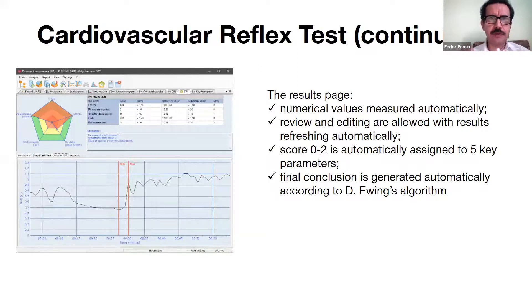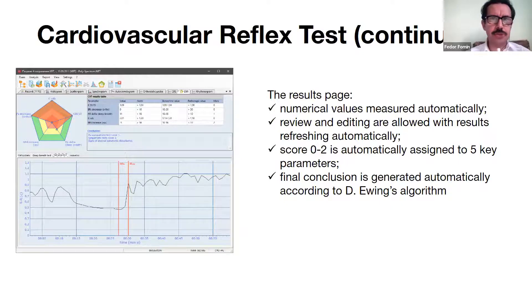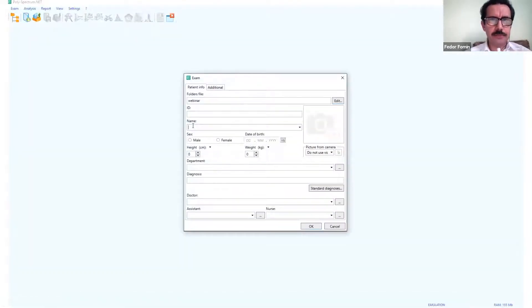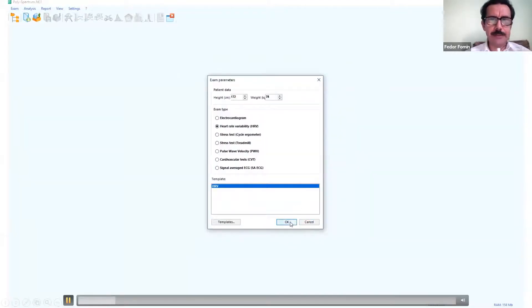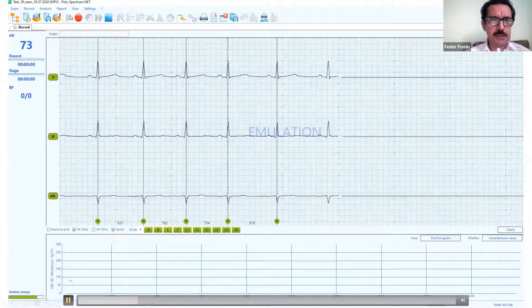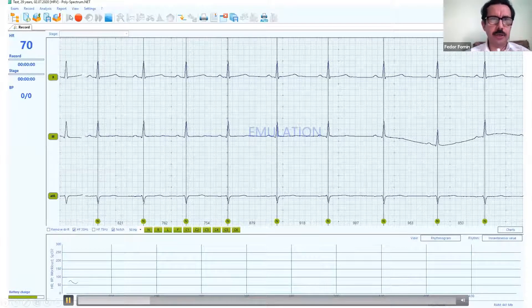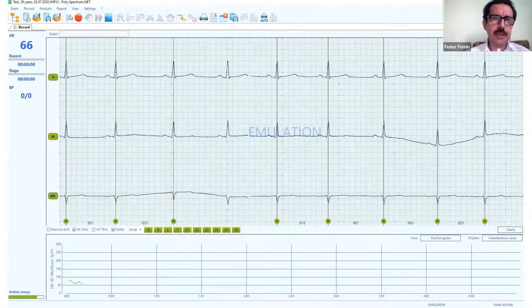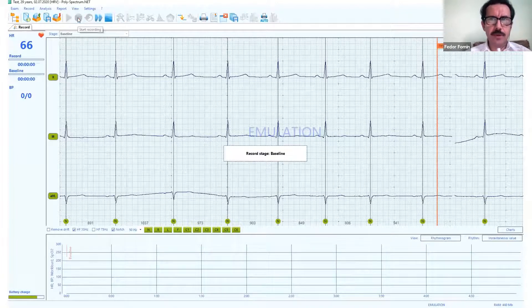This information can change treatment tactics and patient management, and the result is given as a scale from zero to ten, where ten means everything is wrong. Now in this short video recording demo: we start by entering patient data — if a patient is returning, we already have them on file. We select heart rate variability analysis and proceed to monitoring, where we can see the ECG for a couple of minutes to verify the quality of the recording and confirm it is normal ECG before proceeding.